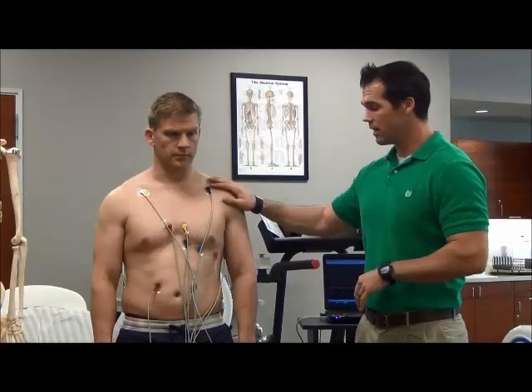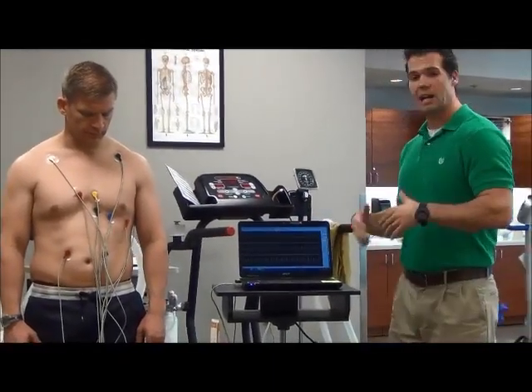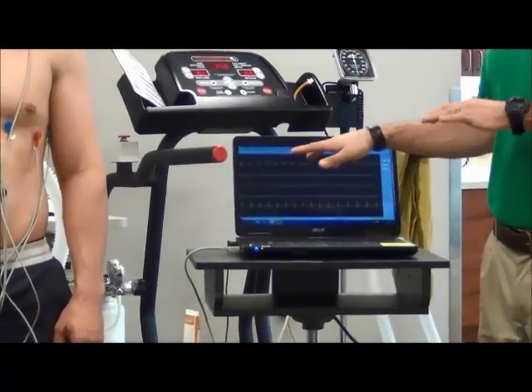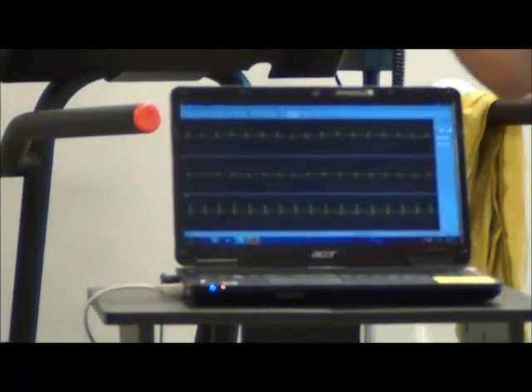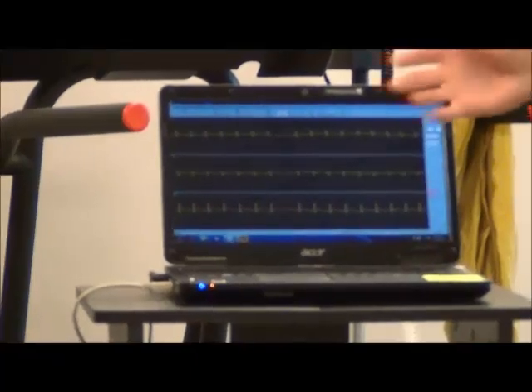So we have Curtis set up. And then next to Curtis, we have the actual readout of the ECG for Curtis. This allows for the assessment of heart rate, but also to make sure that when a client is exercising, or when a client is at rest, that heart is functioning the way that it should.